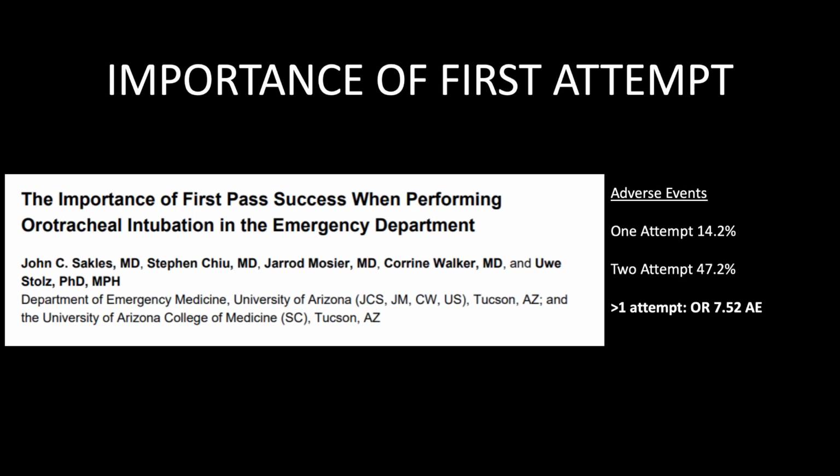Talking about the importance of first attempts, Jake and I have just spent the last hour or so going through all of the different steps of intubation, and at first, to a novice intubator, it can seem quite daunting. All right, why don't we just get some IV access, push some drugs, and go ahead and pass the tube. But everything that we're advocating for is trying to increase your chances of achieving first pass success. First pass success has been shown in multiple studies now, in review studies and in RCTs, to decrease intubation complications.